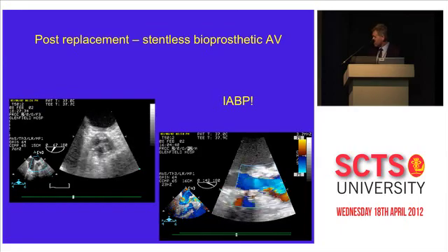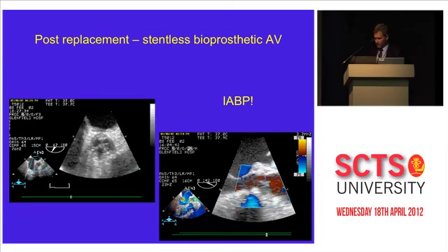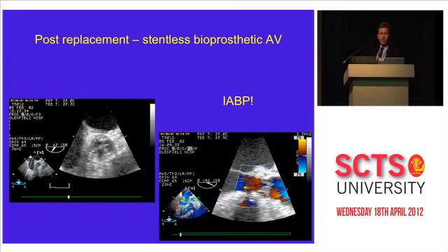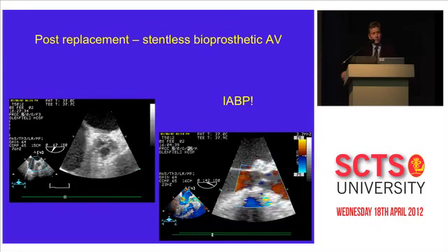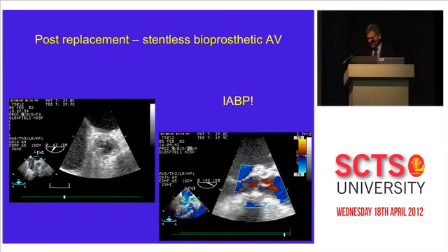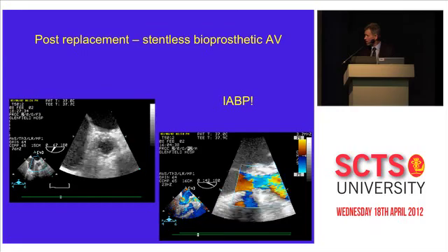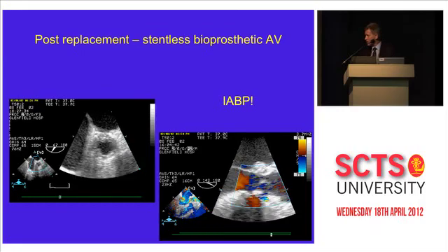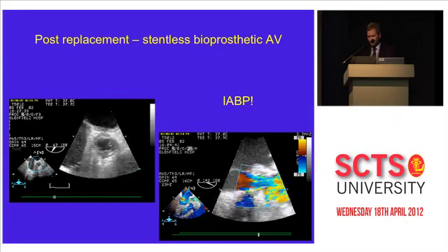And look at this. Just with our echo Doppler, we see the severe aortic regurgitation. We put in a balloon pump, and lo and behold, it did close. So what I don't want to say here is put in a balloon pump when you've got aortic regurgitation. However, in a very special case, you can consider it. In this case, it closed the left coronary cusp, and the patient had no aortic regurgitation and good coaptation.